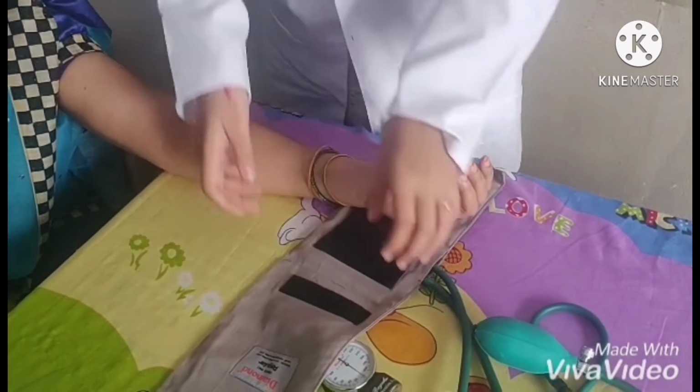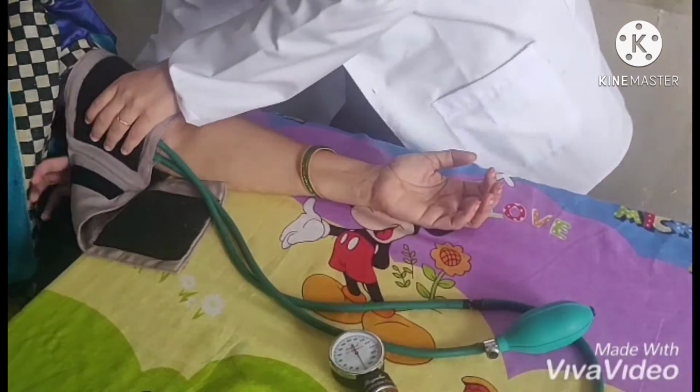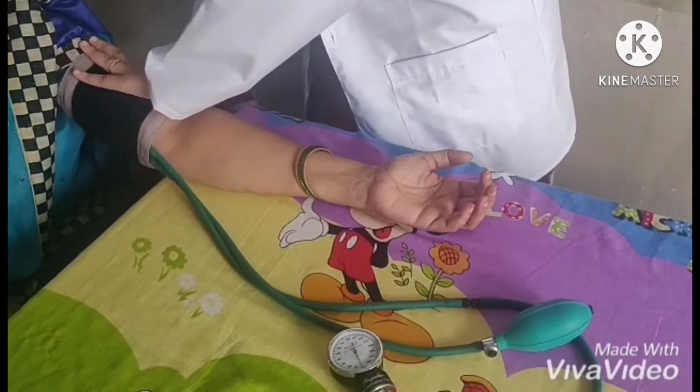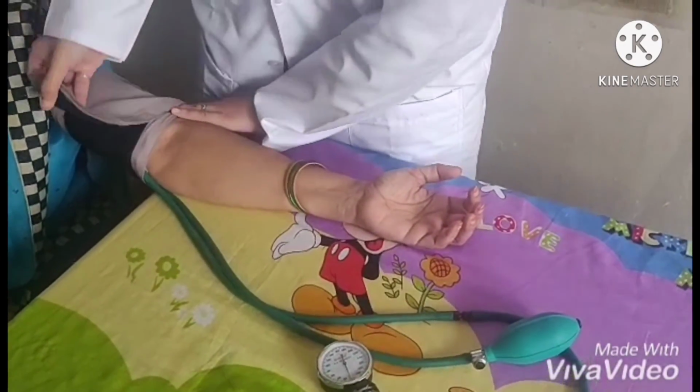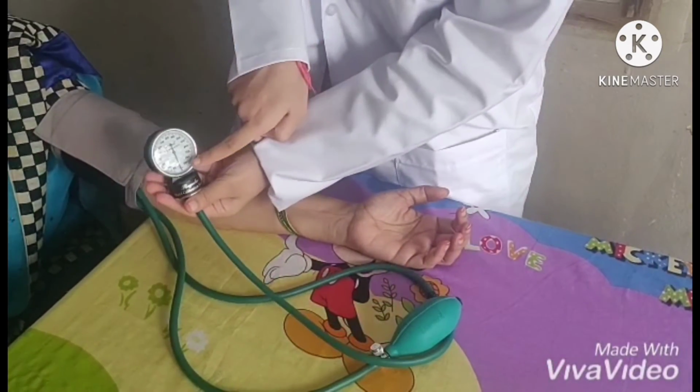Now, palpate the brachial artery. The inflatable bag should be placed right above the level of the brachial artery. Make sure the cuff is not too tight or too loose. The initial level on the manometer should be at 0.